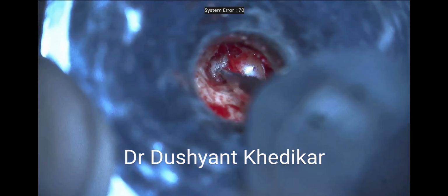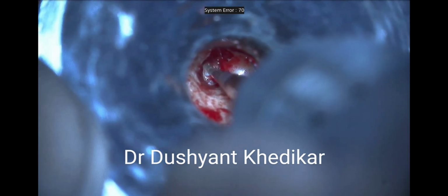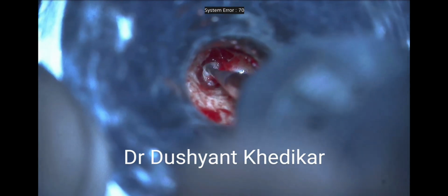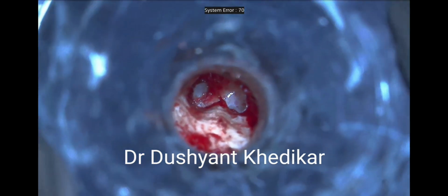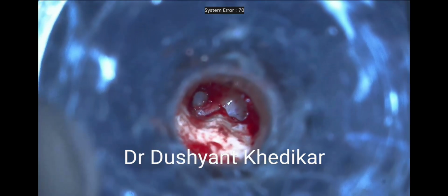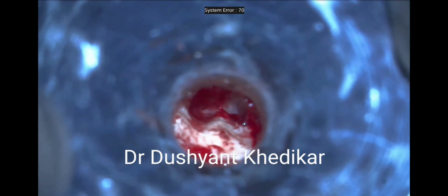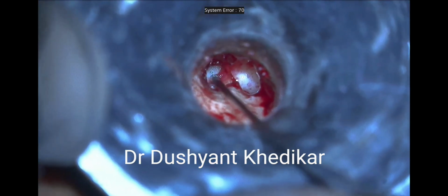Copious irrigation is avoided during the attempt of drilling, as this will hamper the surgical vision. At the same time, before every drilling attempt, the burr is dipped in saline solution so that it carries just an adequate amount of saline with it to prevent the dry drilling. Intermittent wash is given to clean the area.